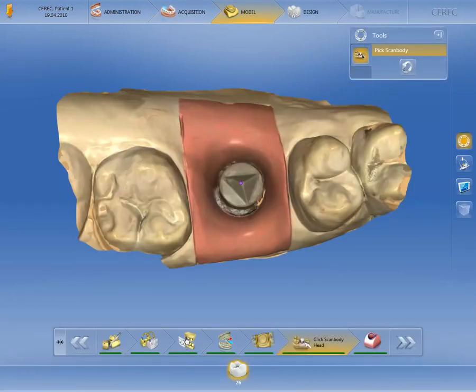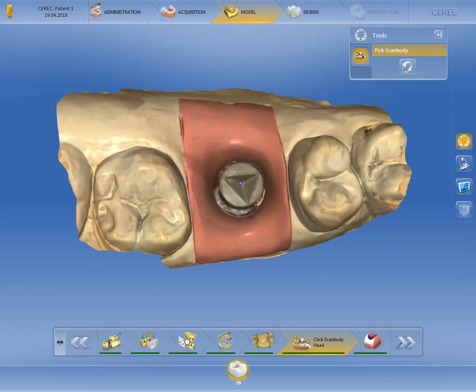In this phase, we have expanded the step menu into full view. The green bars in the individual steps inform you that the CEREC software has automatically prepared all steps based on the scanned data. The purple dot on the scan body indicates that the software has determined the position of the implant. You can check all steps and, if necessary, make corrections.